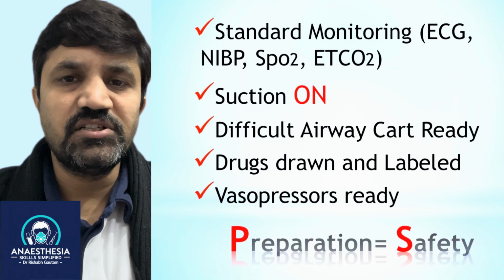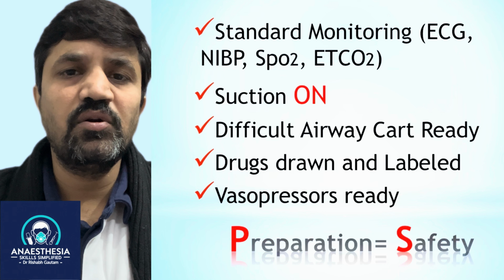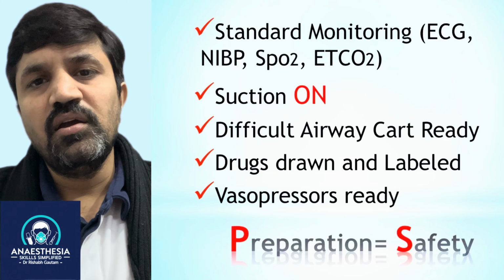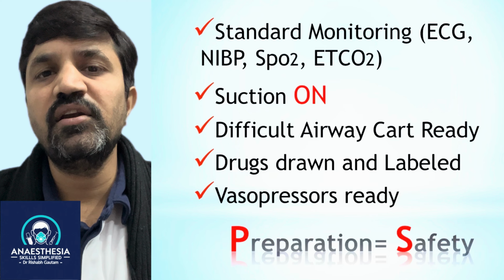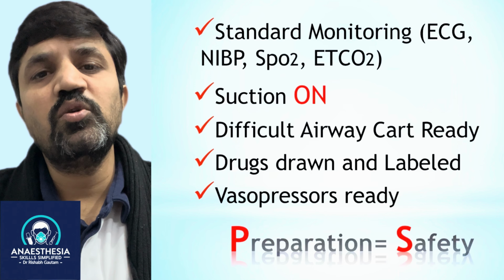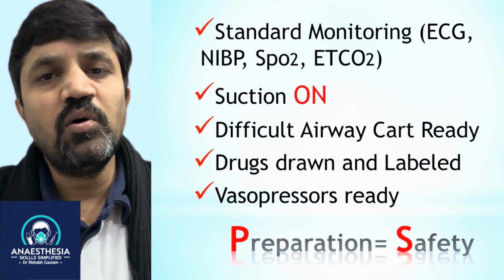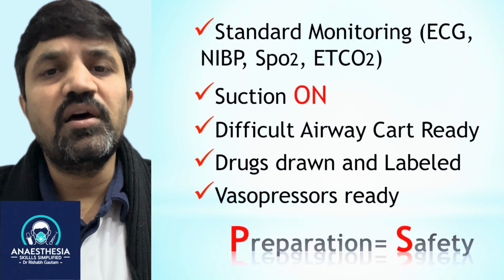First of all, preparation. So you have to prepare all these drugs, draw and label all the drugs, attach all the monitors, prepare your difficult airway cart, and prepare your suction machines. You should have a suction machine in hand and it should be on before inducing the patient. The suction machine should be fully functional. So check your suction machine, which is most important. And as per protocol, keep 2 suction machines ready before induction in RSI.